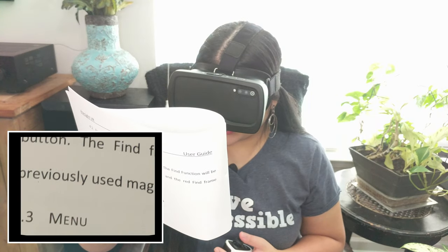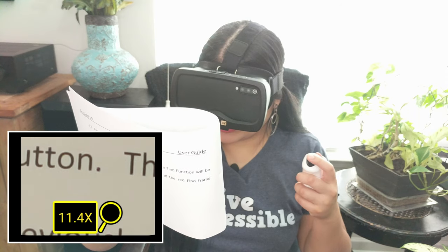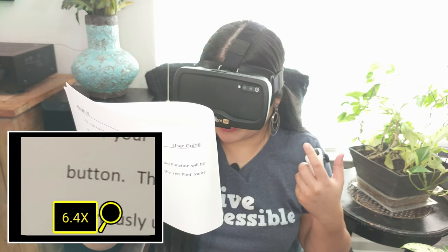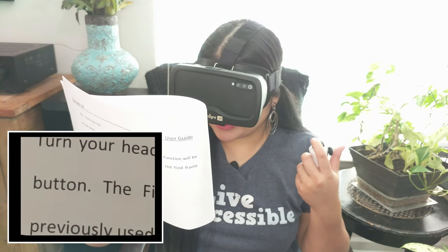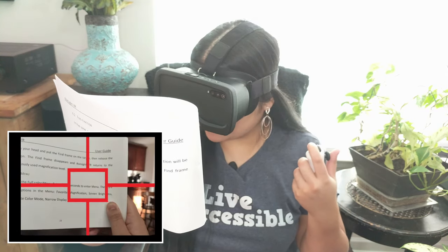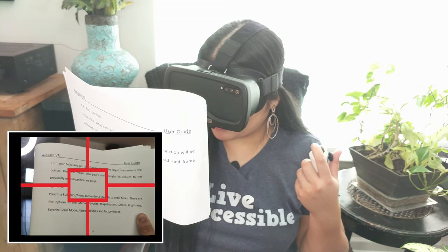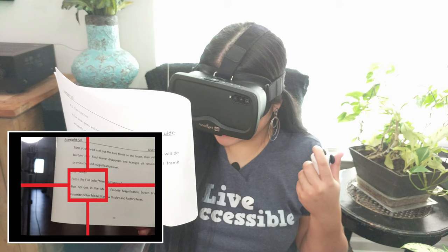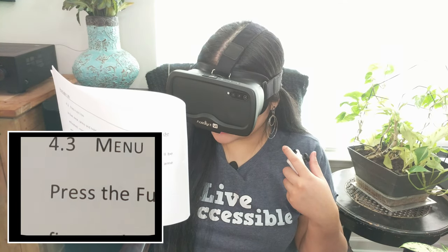The other function that the trigger button does is if you are zoomed in pretty far to a piece of paper or anywhere, and you press and hold that trigger button, it will activate the find feature. You can find what you want to magnify and put it into that red rectangle. And once you have it where you want it, you release the trigger button and then it'll zoom in.